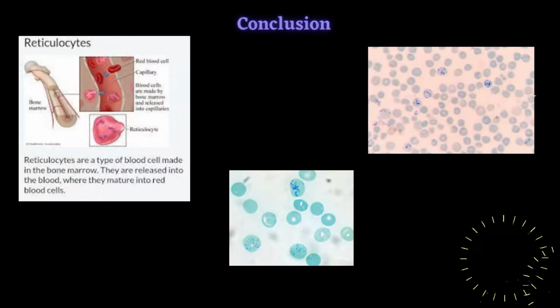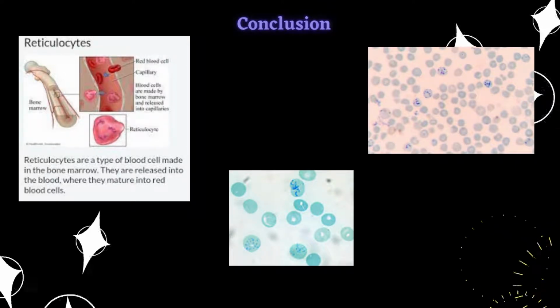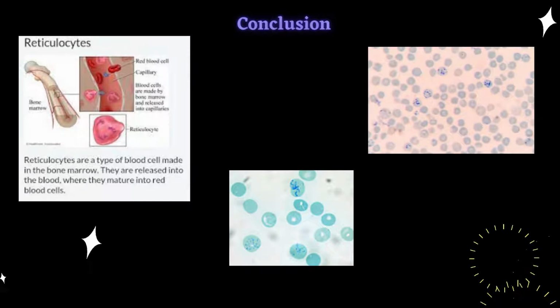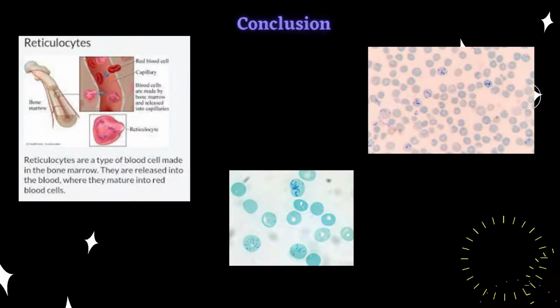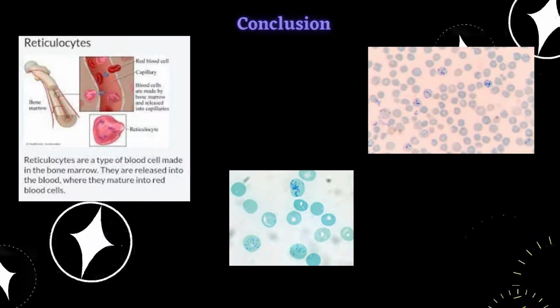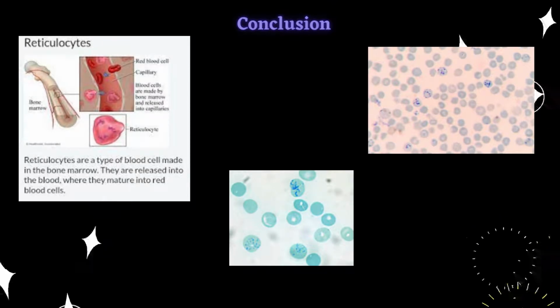In conclusion, the reticulocytes are an important guide of the amount of red blood cells produced in bone marrow and entering the peripheral blood. It is therefore an index of effective erythropoiesis. Its normal fraction in the blood is low, which is 0.5% to 2.5% in adults and 2% to 6% in infants, because there is a homeostasis between destruction of each abnormal red blood cell and a low level of marrow activity required to maintain normal hemoglobin levels.